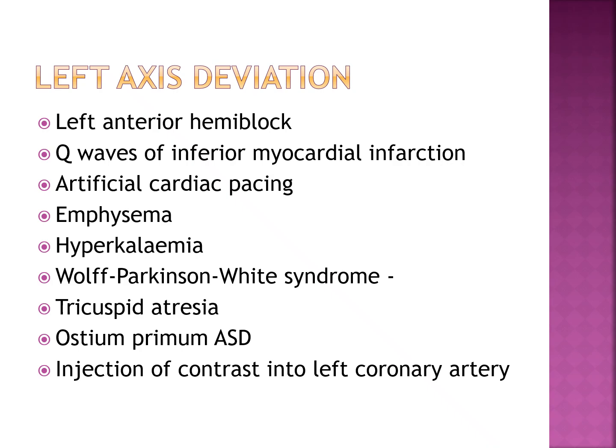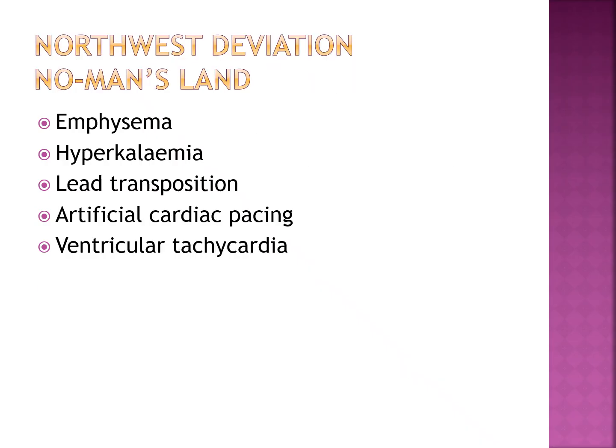Left axis deviation is kind of the same thing. Left anterior hemiblock, Q waves of inferior myocardial infarctions. Artificial pacemakers give you a left axis deviation. Patients with emphysema often have a left axis deviation. Hyperkalemia, Wolff-Parkinson-White, tricuspid issues, etc.